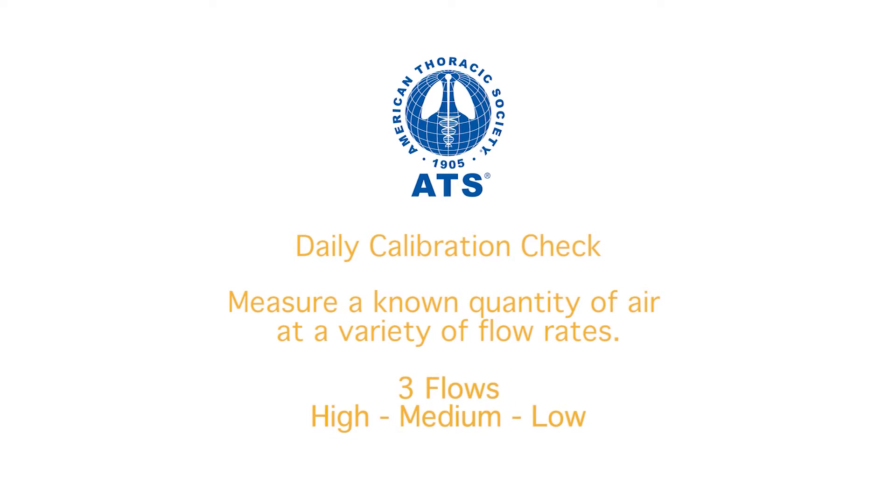For flow spirometers like the MIR spirometers, we need to check the calibration at three flows – high, medium, and low.